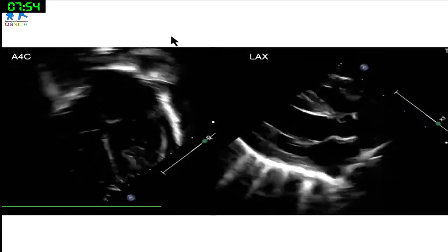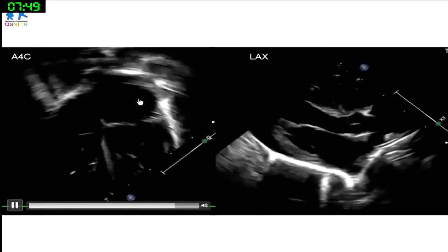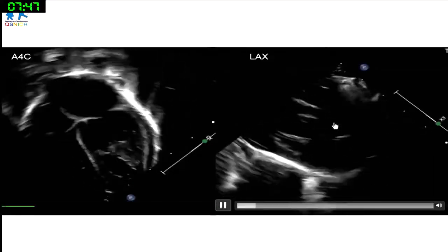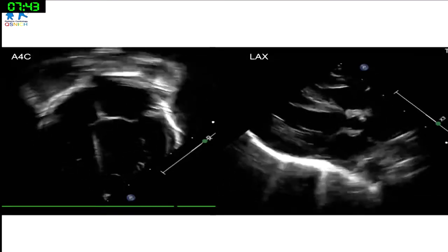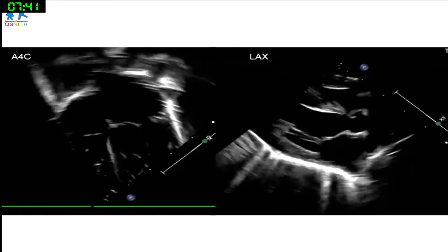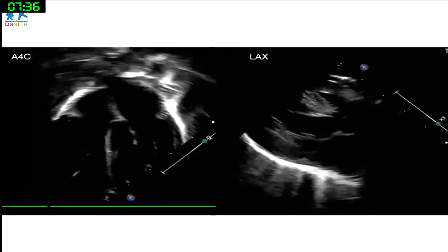This is the echo. There is mild LV and LA dilatation. The VSD is sitting just underneath the aortic valve, and this is clearly an outlet VSD in appearance. It doesn't seem big in comparison to the aortic valve annulus.